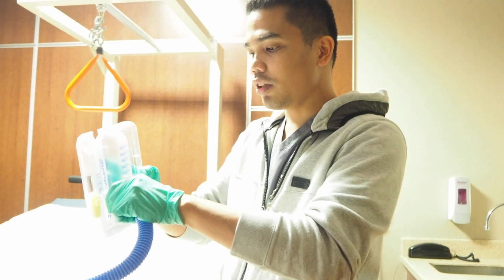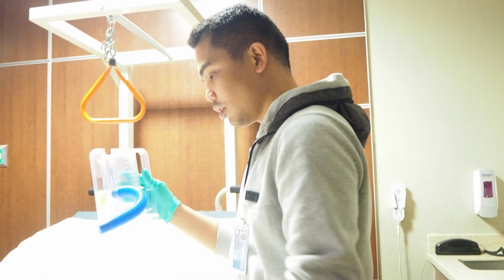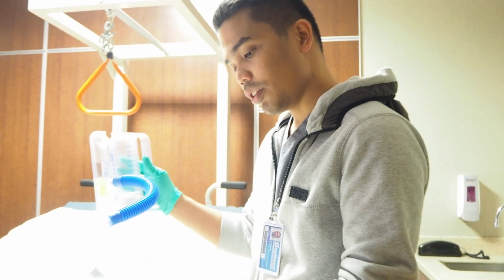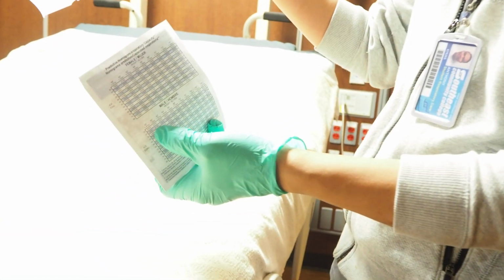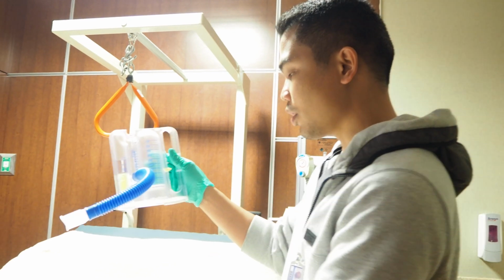And then when holding it, should hold it upright. And then based on myself, as I will be doing myself as a patient, we should set the appropriate volume or pressure based on their gender, height, and age. So mine is almost about 2000.